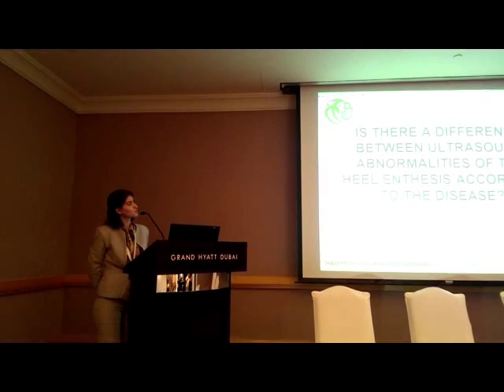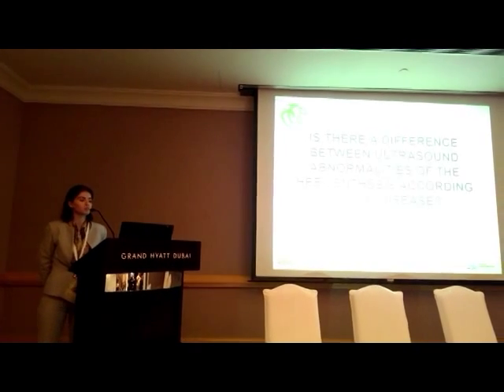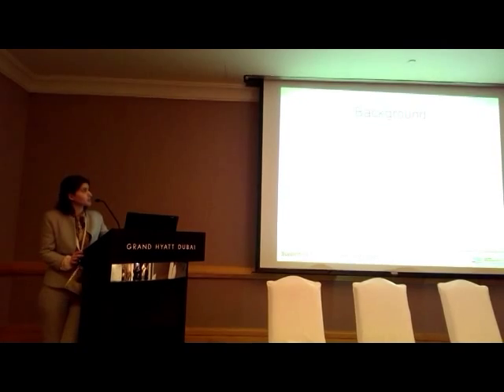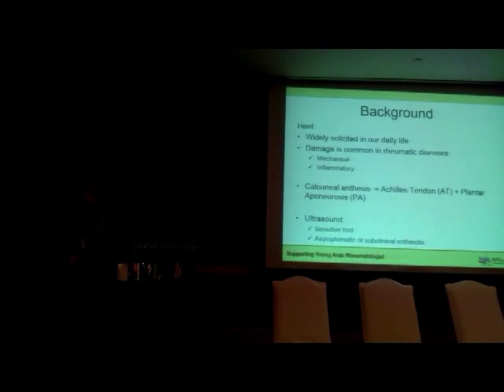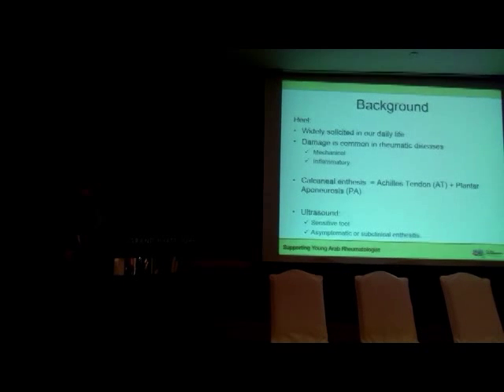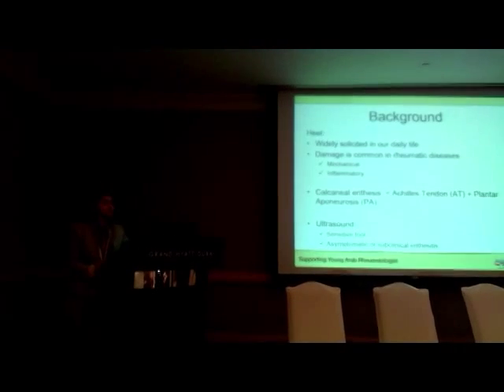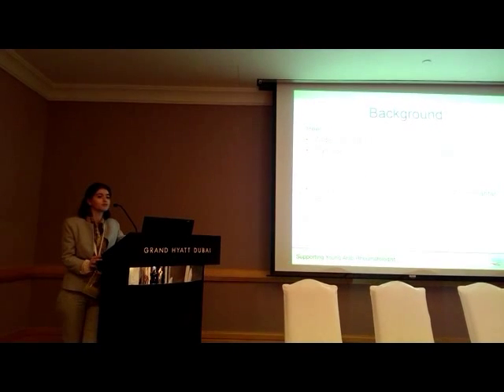I will talk about this work: is there a difference between ultrasound abnormalities of the heel enthesis according to the disease? Our heel is widely solicited in our daily life, and its damage is common in rheumatic diseases, whether they are mechanical processes or inflammatory processes. The Achilles tendon and the plantar aponeurosis form the calcaneal enthesis, and ultrasound is a sensitive tool for detecting subclinical enthesitis, even asymptomatic.